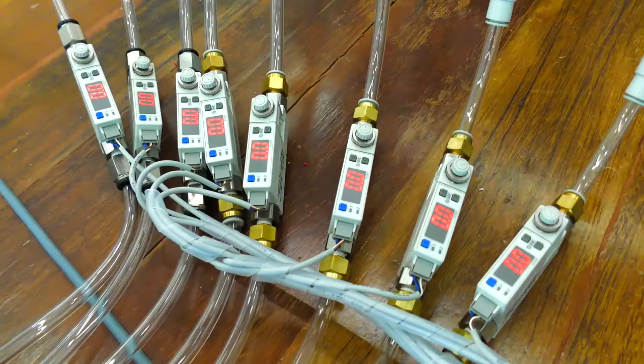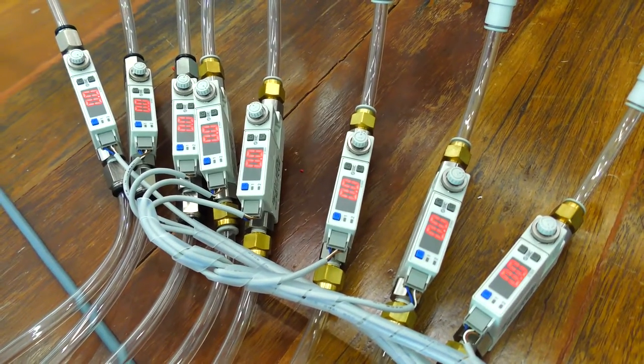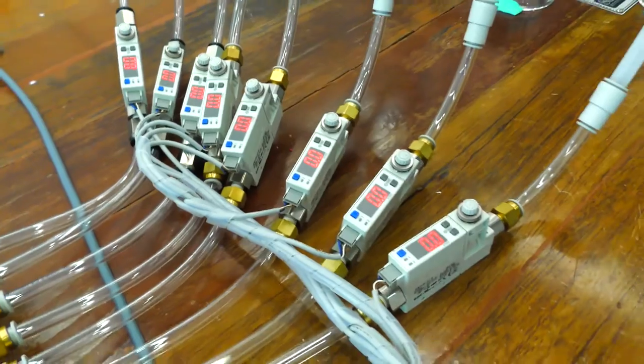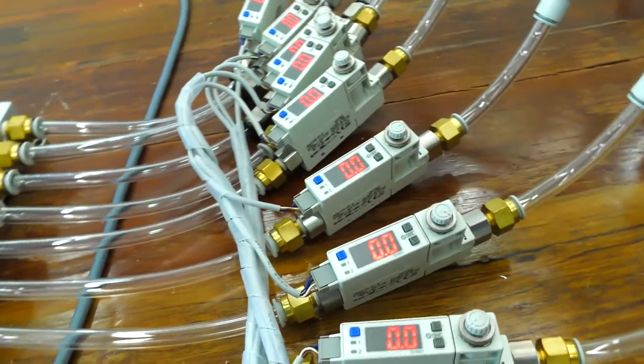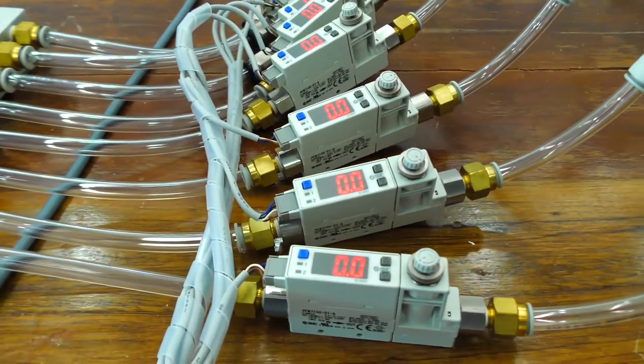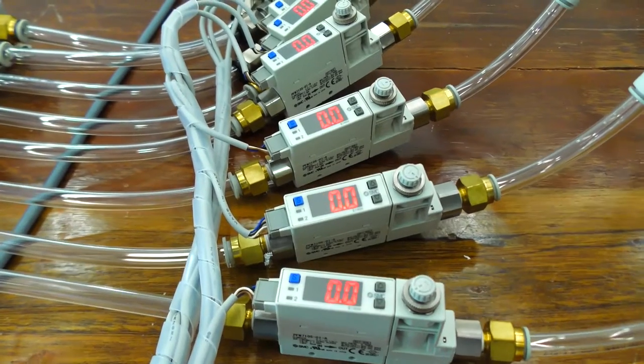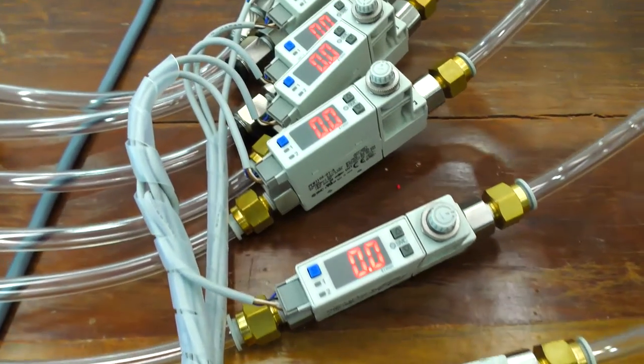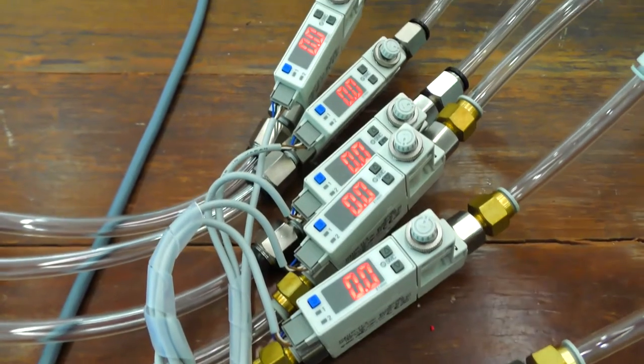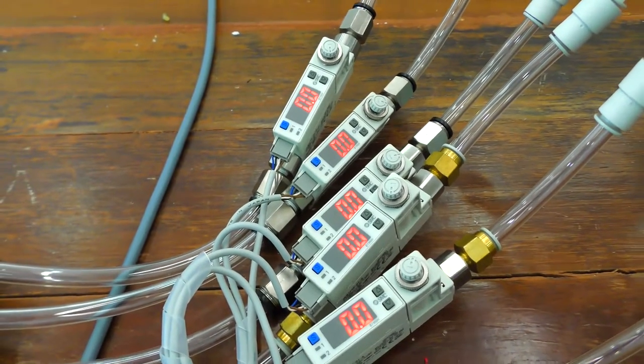From the manifold, it consists of one input and eight outputs where the output will flow to the two-color digital flow switch. We must make sure that the flow rate here must be between 3 to 5 liters per minute, to make sure that our nose is comfortable. Because more than 5 liters per minute, it will make our nose discomfort.